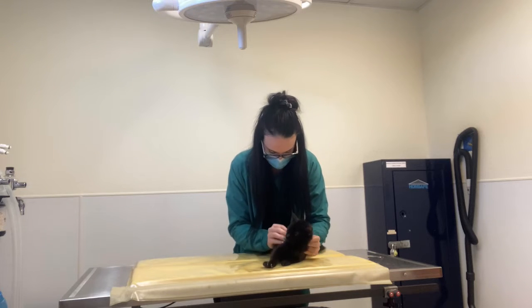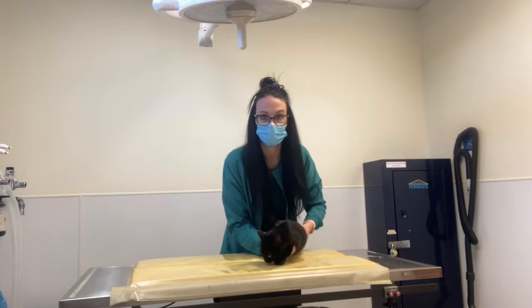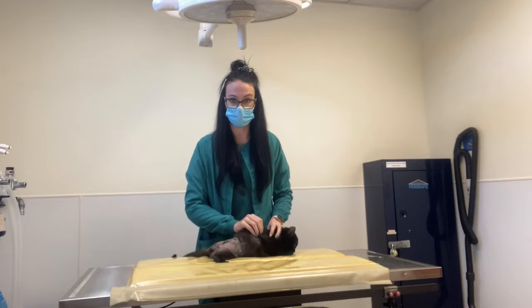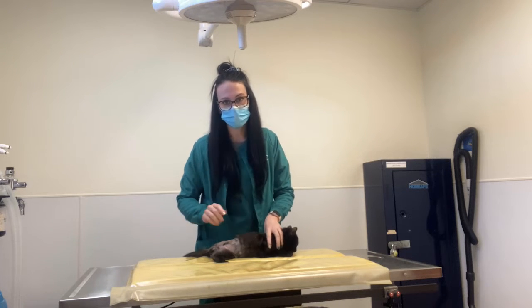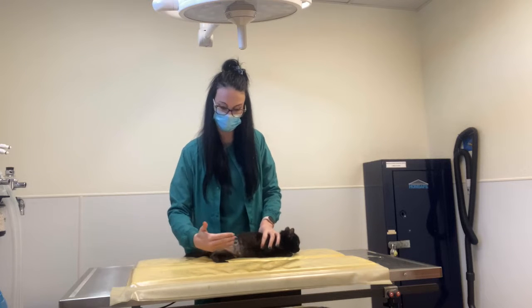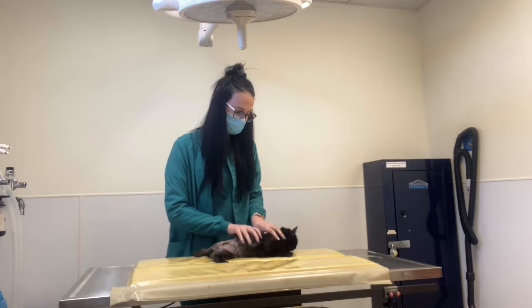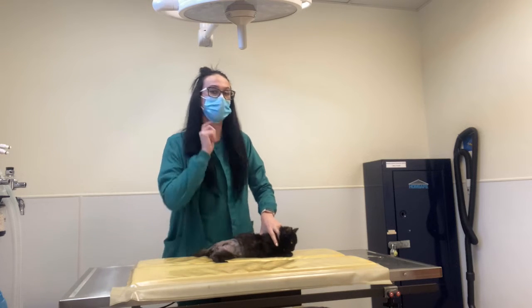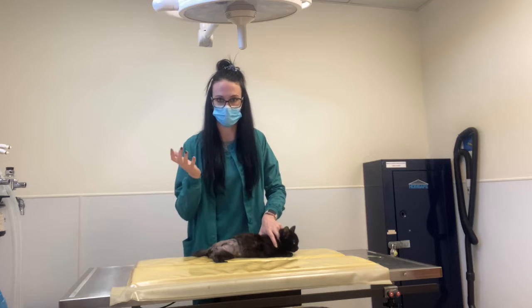And then for a saphenous vein, like I said, she's a tripod, so we're fear-free, so we try to scruff as little as possible. So she can actually sit sternal, and it's a little easier since she's a tripod now, because I don't have to hold that leg back. But if she had all 4 legs, I just have my fingers securely around, right behind her jaw, so if she tried to turn, she couldn't. She would run into my fingers.